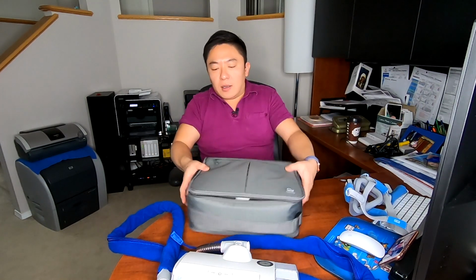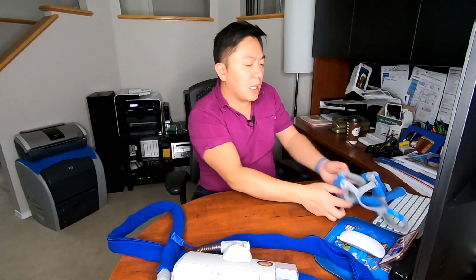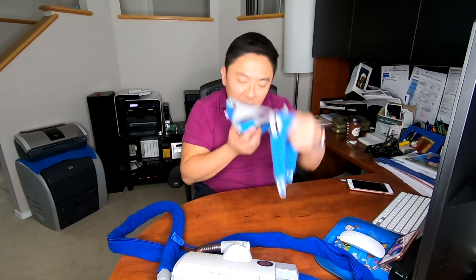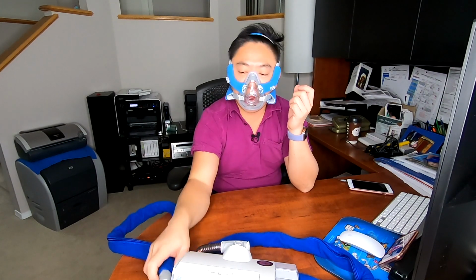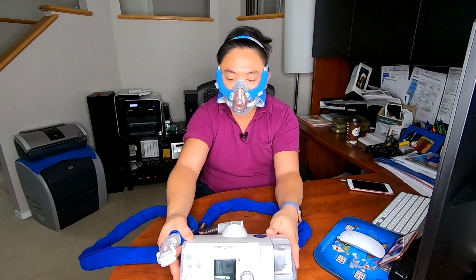And so, travel bag, really good for traveling. And using a CPAP machine is fairly straightforward. Right before you go to bed, you put on this sexy looking face mask like this. With the modern masks, they actually now use magnetic clasps to hold things together, so it's really easy to use. You just put that on, and then you fill up water into your humidifier if you need it, and then you plug this elbow onto the hose and hit start.